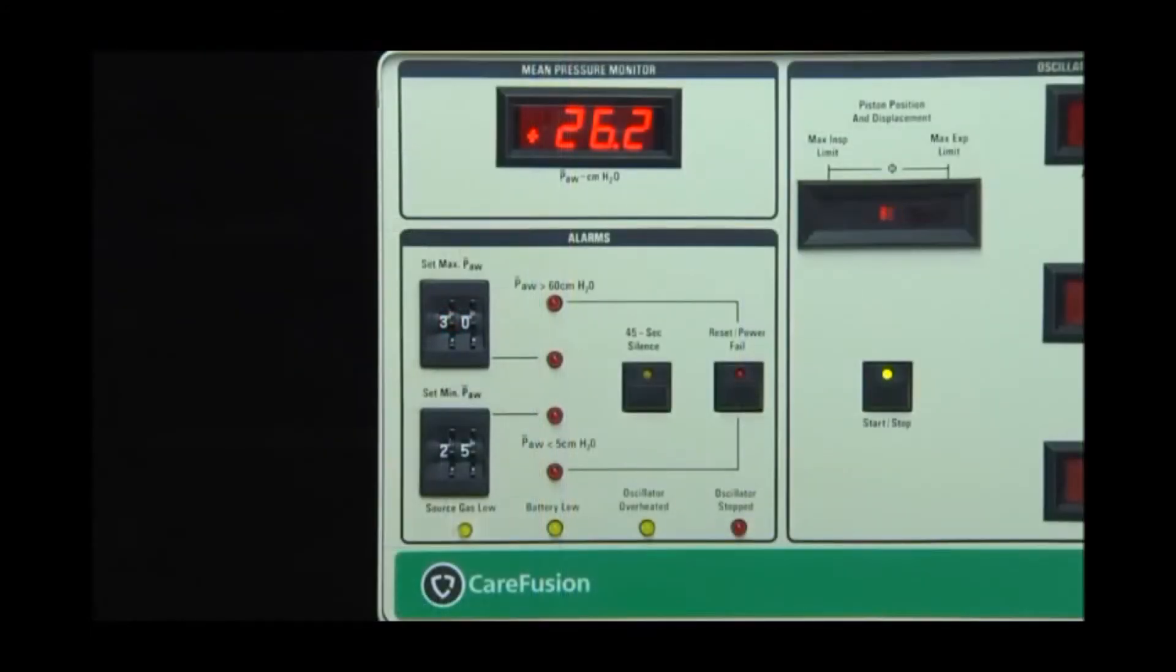If the alarm for the set minimum mean airway pressure is triggered, audible and visual alarms are activated. The audible and visual alarms automatically reset upon resolution of the fault condition.